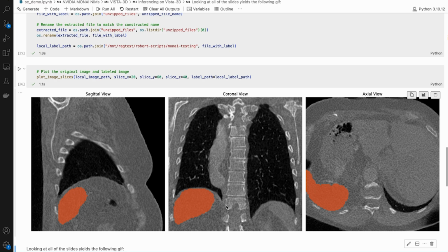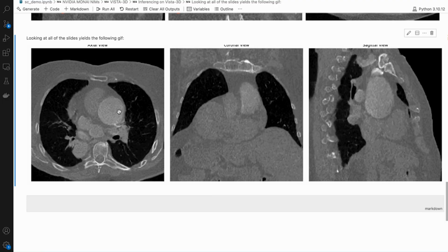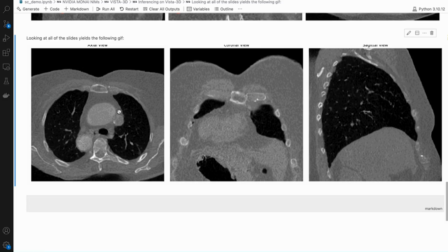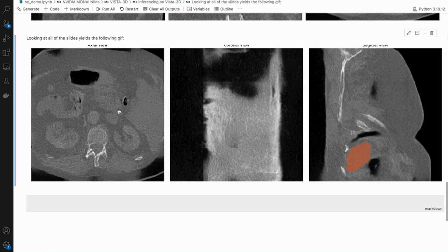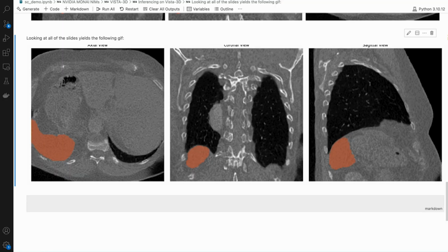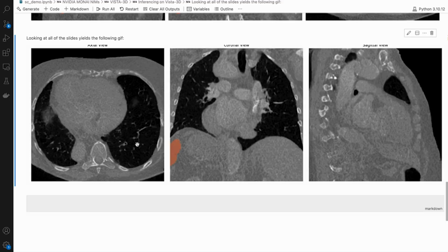And furthermore, if we actually think about the whole image, the whole movie of that image, here is this GIF that's going to be playing that's going to actually be segmenting that spleen throughout the entire body for doctors to use for drug tracking or tumor detection. As you can see here, it starts over here on the right. But as we go through the whole body, it actually starts slicing each of those individual organ pieces for us.